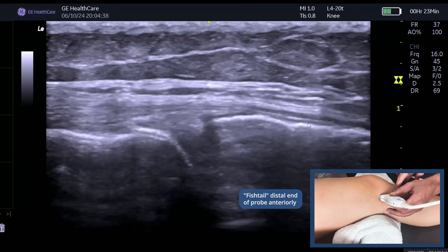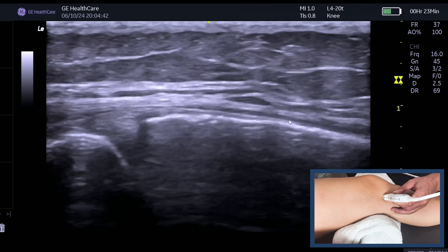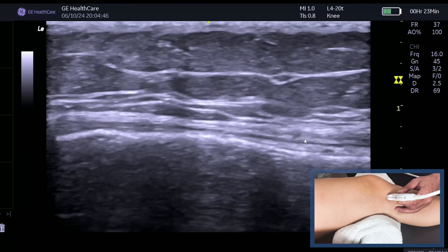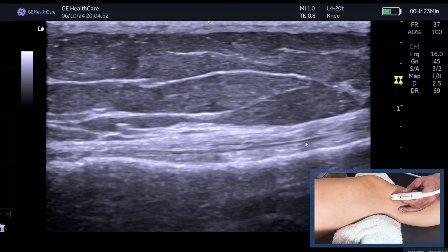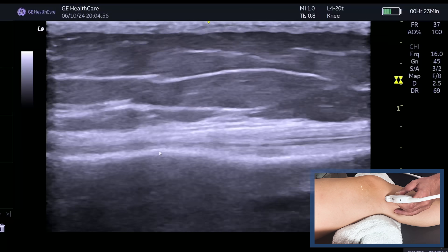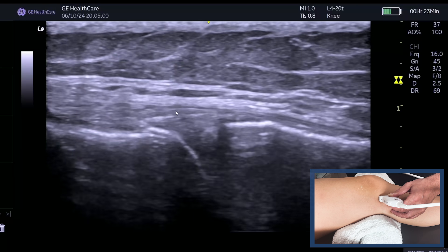When you come distally, you need to fishtail the distal end of the probe anteriorly. Then you can keep that lovely band of the superficial fibers going all the way down and attaching onto the tibia. You can see this going all the way through here.